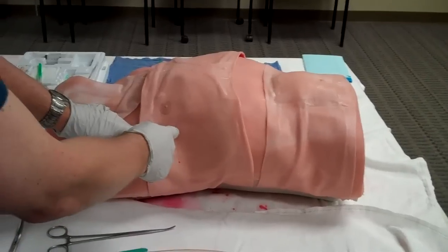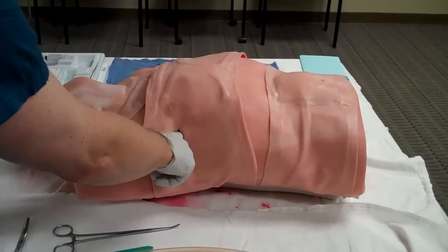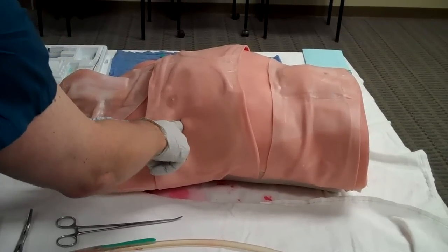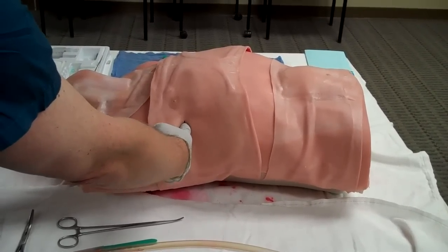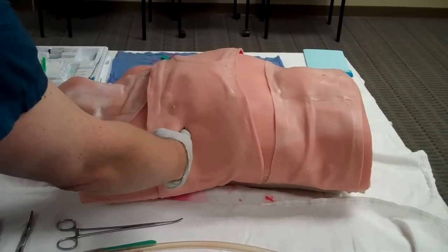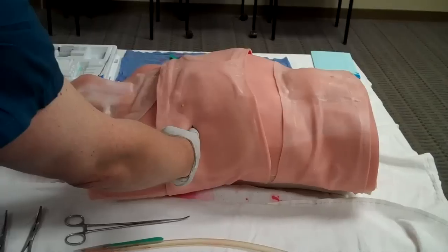The next maneuver then is to put your finger into the chest completely. You should be able to feel where the hole in the pleura is, and you can also make sure that the lung is not adherent to the chest wall. If it is scarred up against the chest wall, then trying to insert a chest tube through that may cause quite a bit of bleeding and more damage than it's worth, and so you may need to rethink your technique.